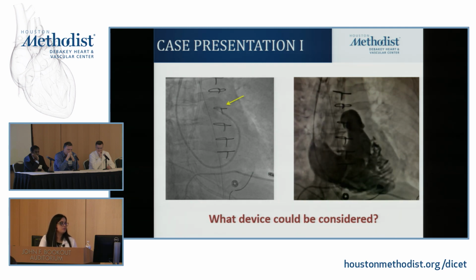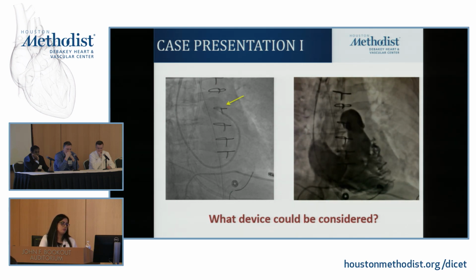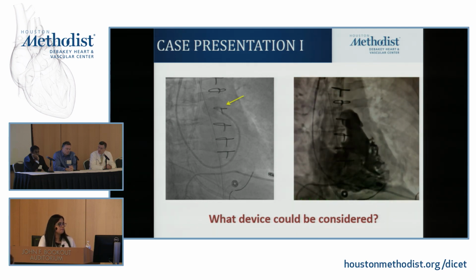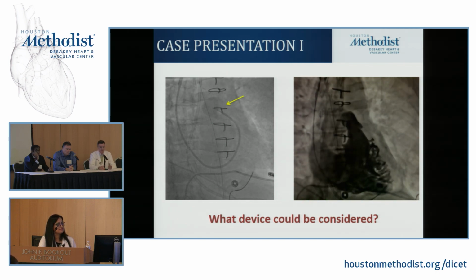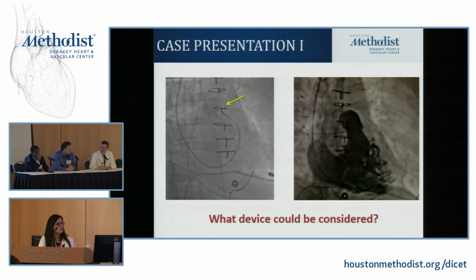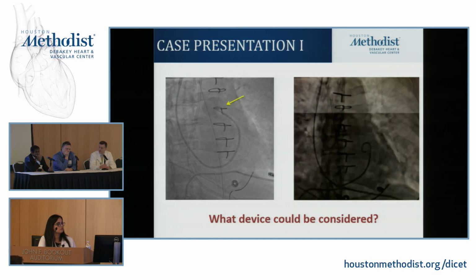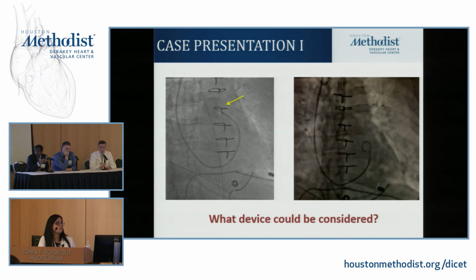But Dr. MacGillivray, if she were to live and if we were to offer her some kind of device, in this situation, if you have somebody who has high resistance, would you consider some kind of an extra device to help vent the ventricle? Yes, some kind of right ventricular assist device with the chest open. We would consider putting a CENTRIMAG in, or if it were a different circumstance, I think putting in a PROTEK Duo or a right-side IMPELLA would have been a good option. But I guess that's after relieving the obstruction. Yes, after relieving the obstruction.